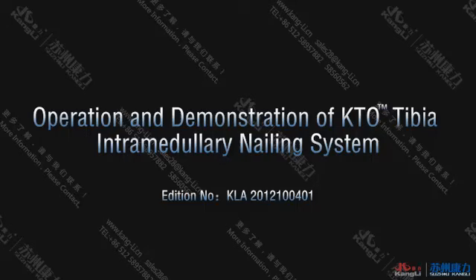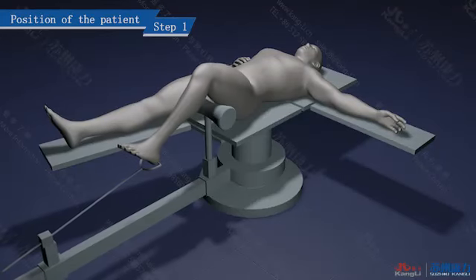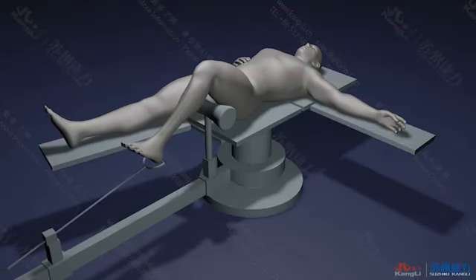Operation and demonstration of KTO Tibial intramedullary nailing system. Step 1. Position of the patient. Place the patient on the fluoroscopic operation bed in supine position. The injured knee joint should flex at least 90 to 100 degrees for the insertion of the nail. Perform traction reduction for the fracture, and when satisfied, fix it on the orthopedic bed.